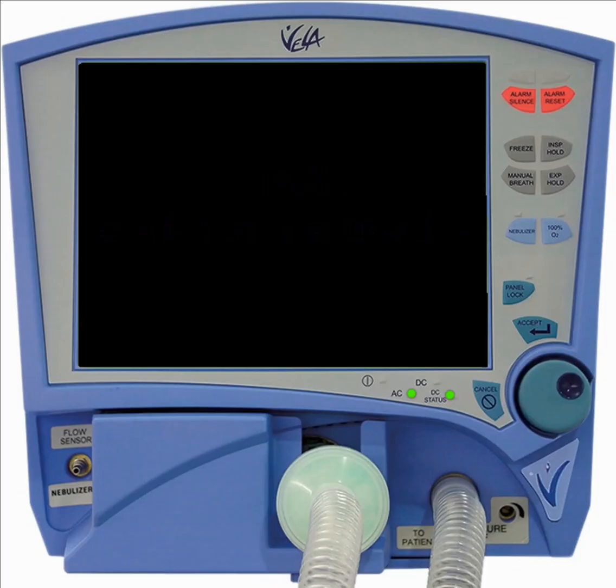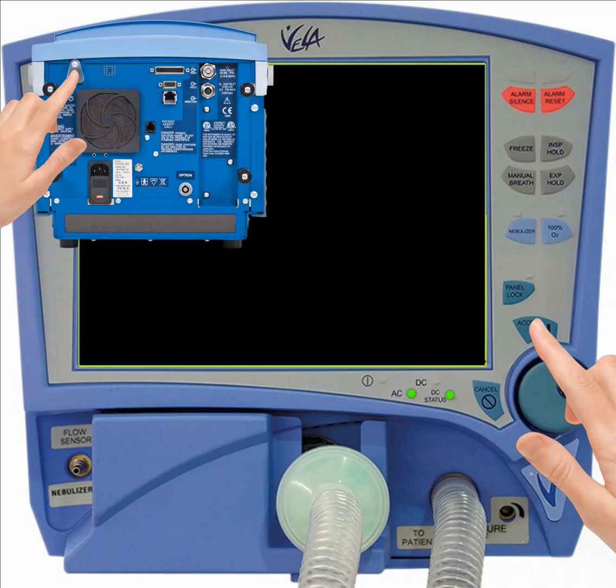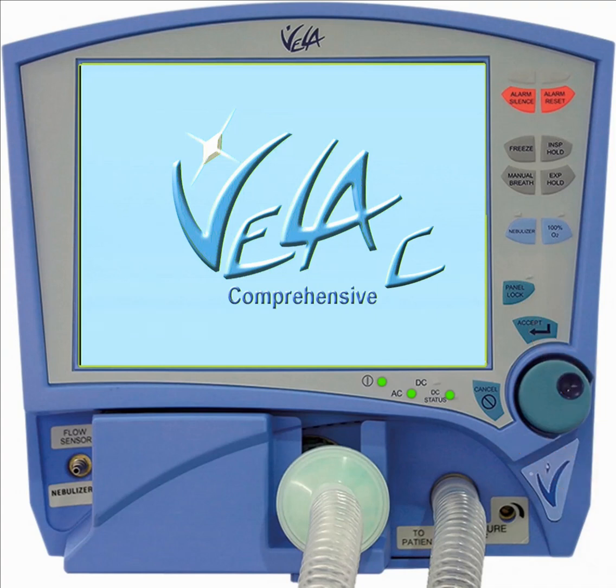You're now ready to begin operational verification testing. To do this, simultaneously hold down the accept key on the front of the ventilator while switching the power on at the rear of the ventilator. It's normal for the ventilator to alarm during this process.